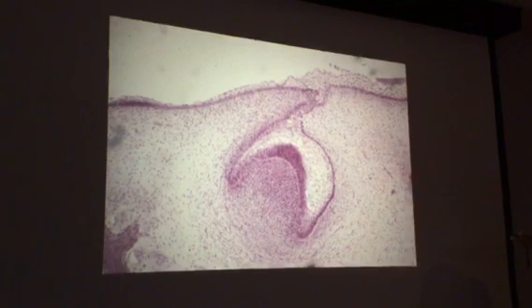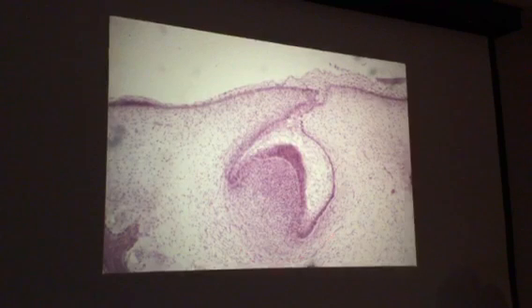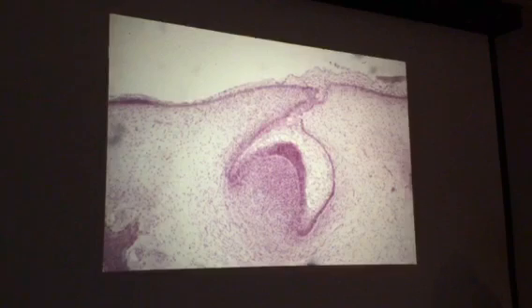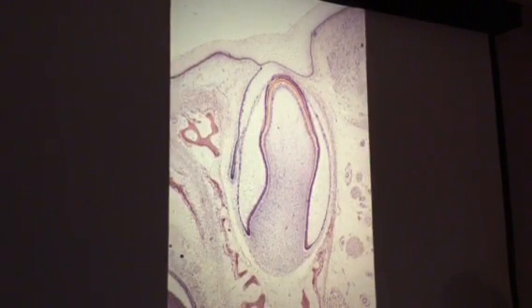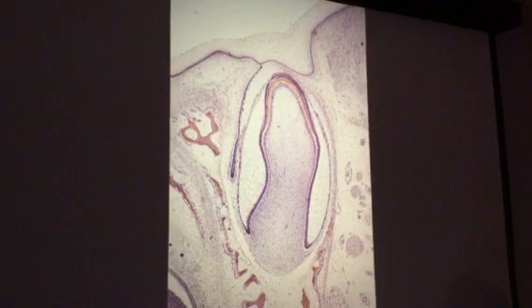And how about this in here? What is that? Stellate reticulum. And surrounding this, you get a kind of a hint of that. What is that? Dental follicle or sac. Okay, and what stage do we have here? Late bell stage. Why? Because we have dentin and enamel being formed.